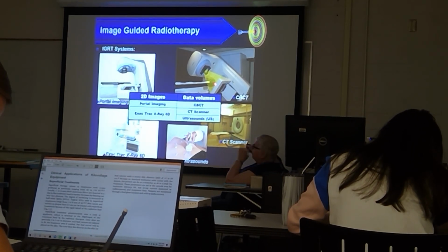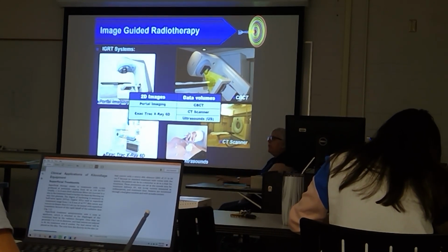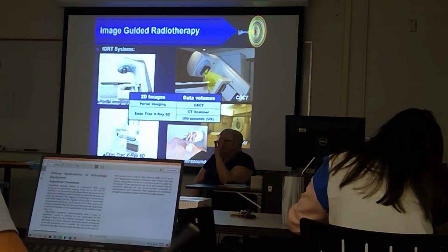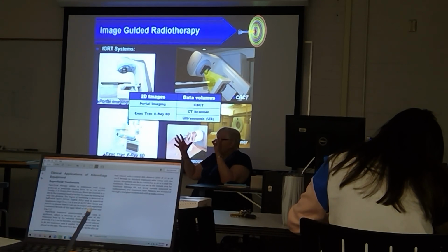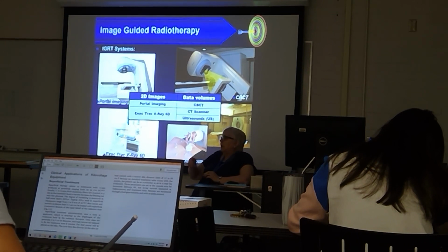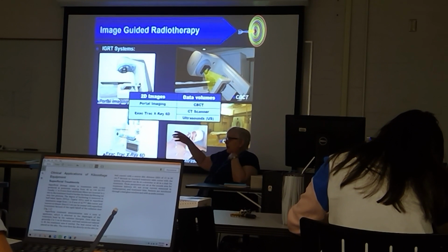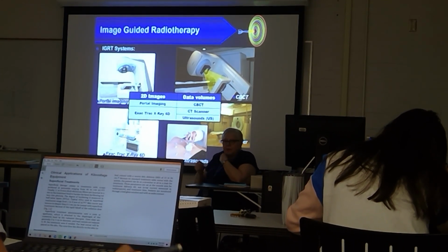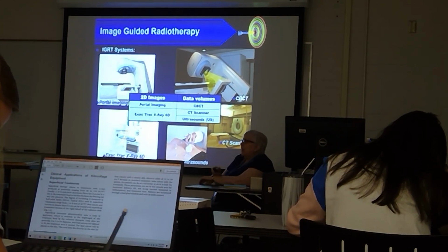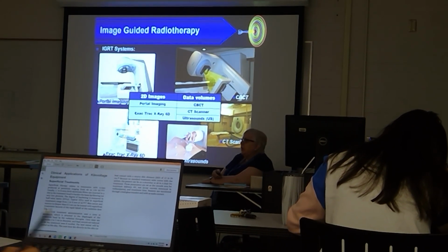Okay, so ignore that. Cone beam is used with the kV imager. The kV imager has two lots of software. One does actual kV images like X-rays, like films, like normal X-rays that you would get in a doctor's office, those types of images, although much less dose. But that would not be considered IGRT? It could be considered IGRT. Does it come up immediately? Yes. Oh yeah, you can bring them up.